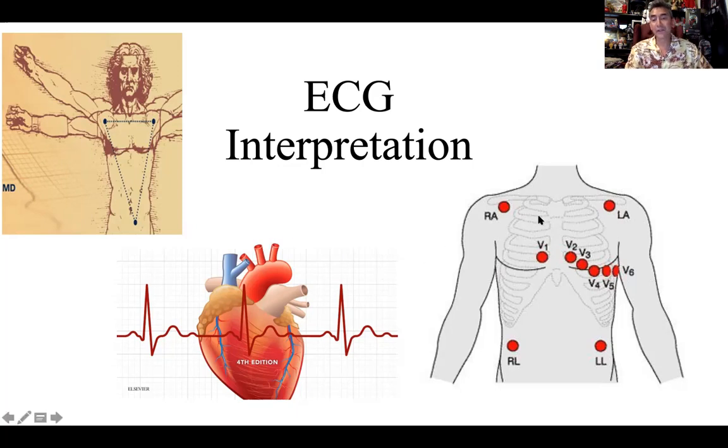On a 12 lead, you do have to kind of get up close and intimate with the individual. And again, we wouldn't do the 12 lead in lab. We would do the simple 3 lead. But we're trying to generate a triangle, and I'll show you another picture of that very shortly. We're trying to get a view of the deflection waves, the depolarization waves, the P, the Q, the R, the S, the T waves, right?